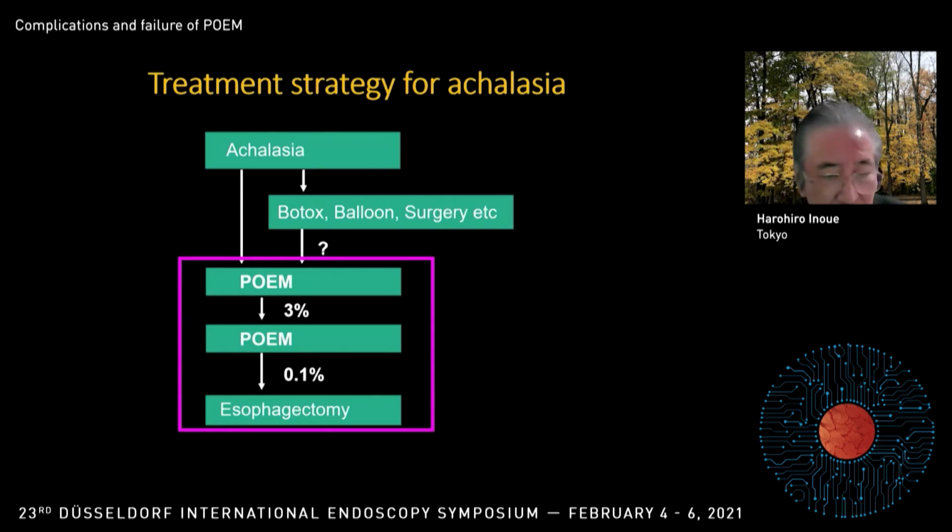So this is our data. In our hospital, all the patients receive the POEM procedure, and among them 3% of patients receive a second POEM. If two POEMs are ineffective, which may happen in 0.1% of all cases, they have to receive esophagectomy.